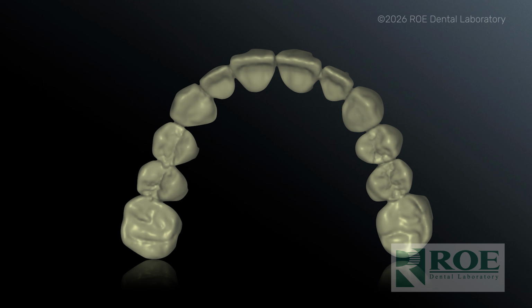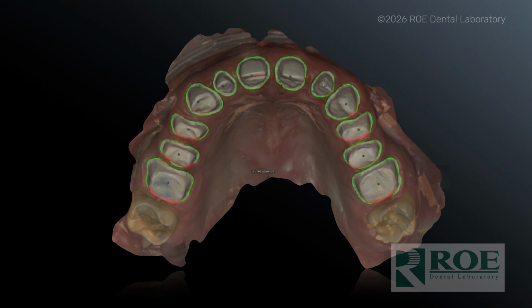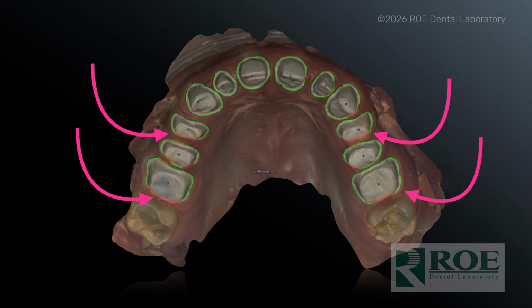Okay. Now, what I love about this is we all want this big chain like this, but we don't really want a chain full arch. It's very rare that we get a full chain, because so many times our preparations based on the arch and the flare of the teeth are proclined or retroclined, and we have undercuts. Even if our preps have 6 degrees of taper, there are undercuts eventually as you go across the arch. So these undercuts become problems, because if I tell the lab to do a full arch, what happens is they have to have path of draw.